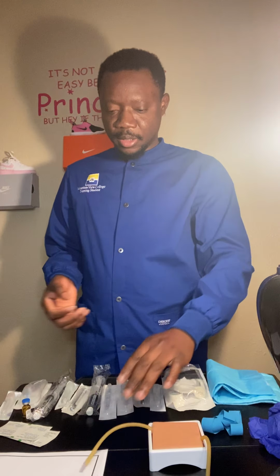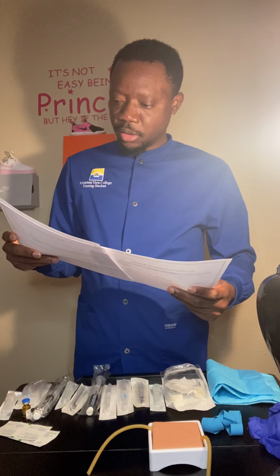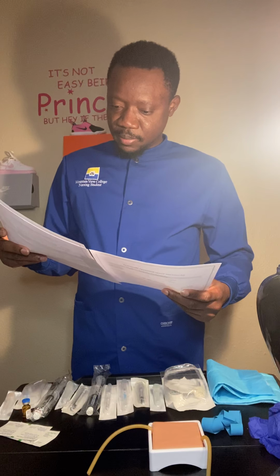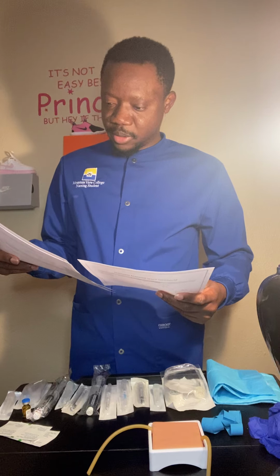Okay, today I'll be demonstrating how to start an IV and administer medication. So my order, the first thing I have to do is I will verify my official order of my medication record. So I have a Wanda Chi, date of birth 9/20/20 SX, no allergies, start IV now by 9 a.m. Mepridine 50 mg, slow IV push over 2 minutes now.